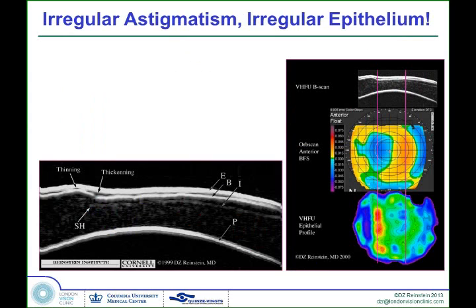Now, these scans were, is that Gerhard? No, it's not. Okay. I thought it was Gerhard Youssefi because he was involved with me. He's the Bausch & Lomb scientist. We sent him these ultrasound scans when we were in Vancouver 12, 13 years ago, and showed him anatomically that the short hinge was accompanied by a massive thickening of epithelium over the bump, which is the area where no tissue was ablated, where it should have been ablated.